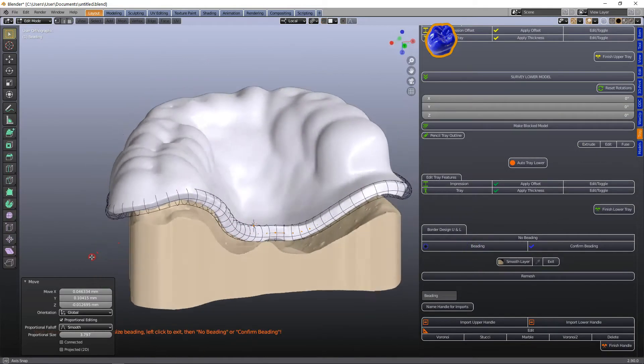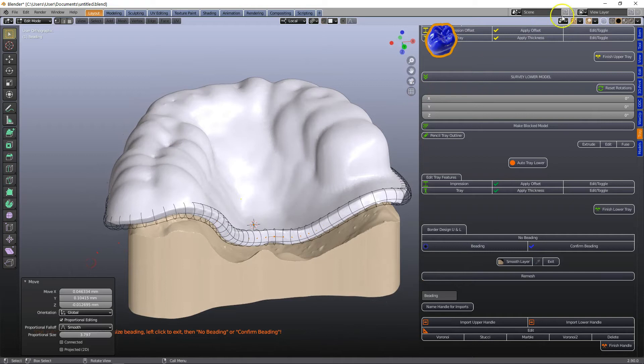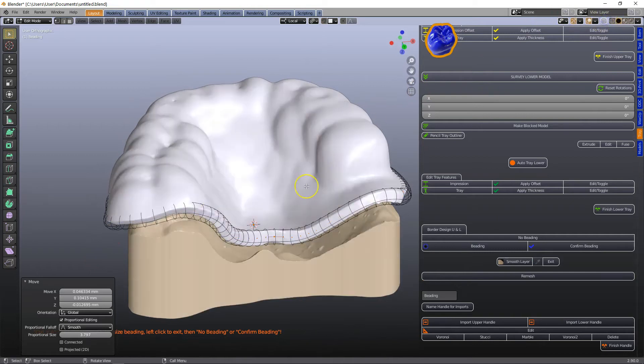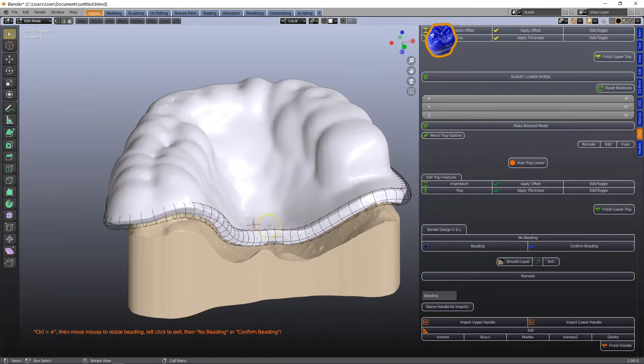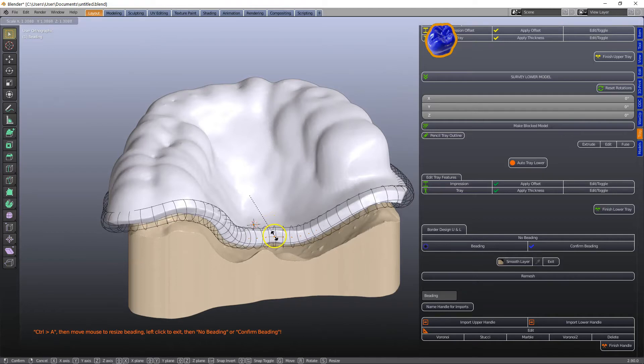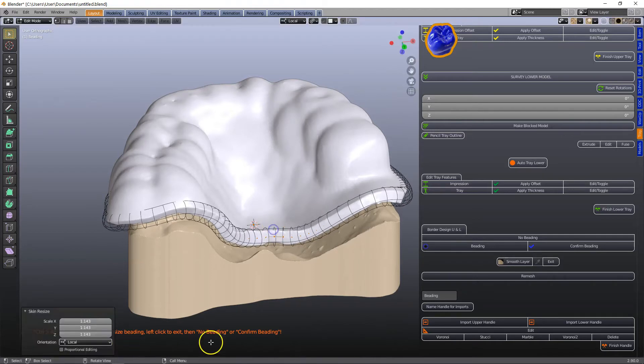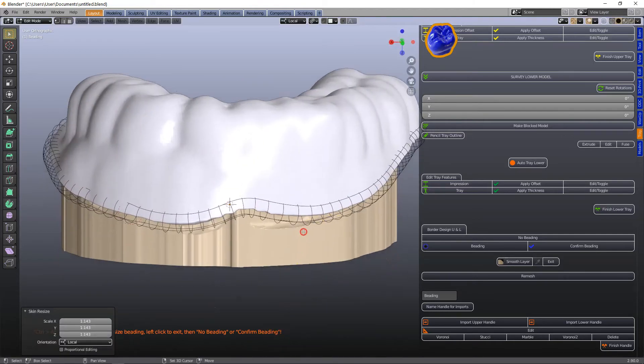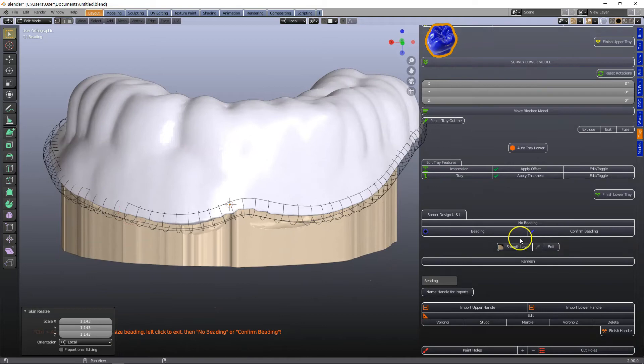Then I'm going to click on beading and this tube is really cool because control A we can make this tube thicker or thinner and this will make a nice smooth ending to our border.